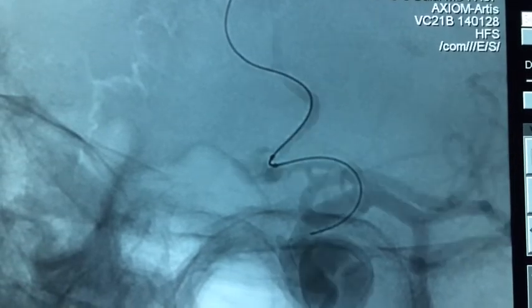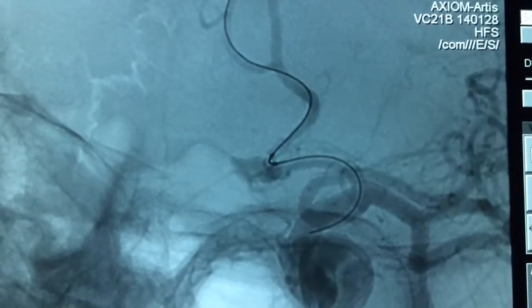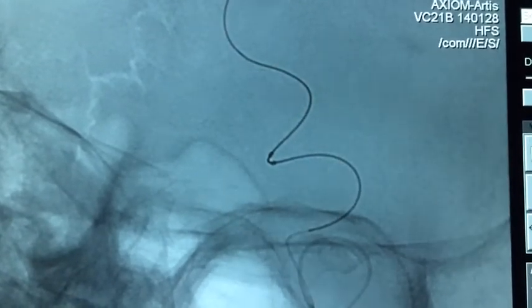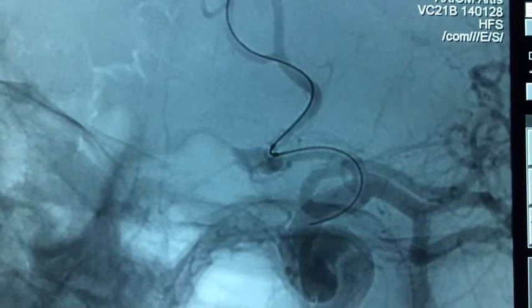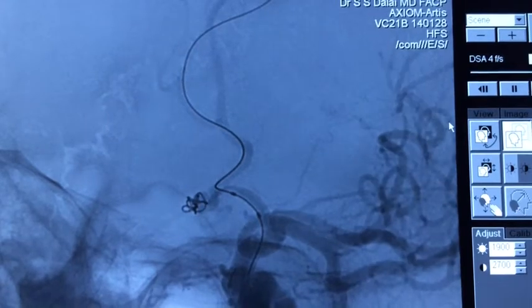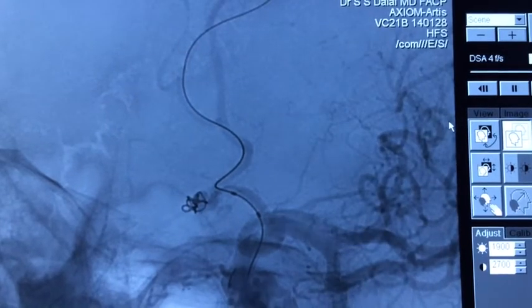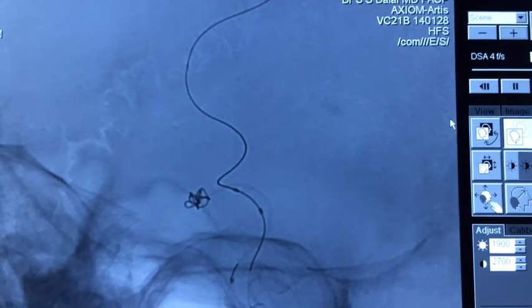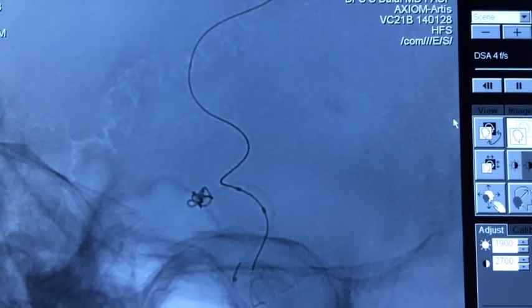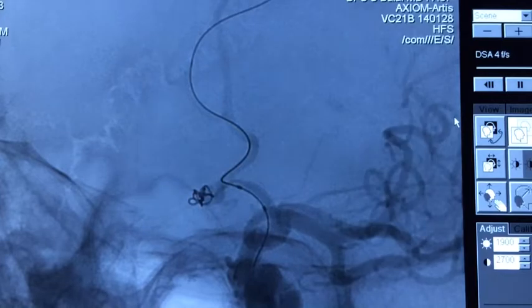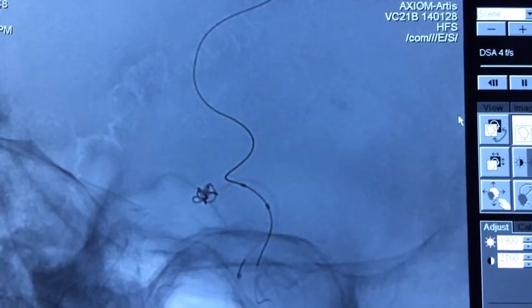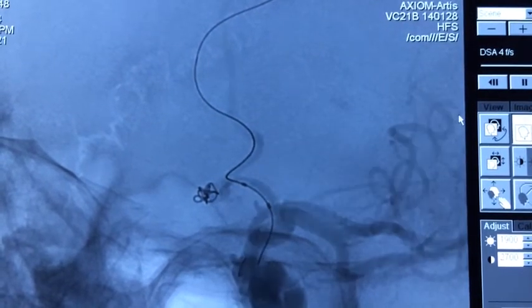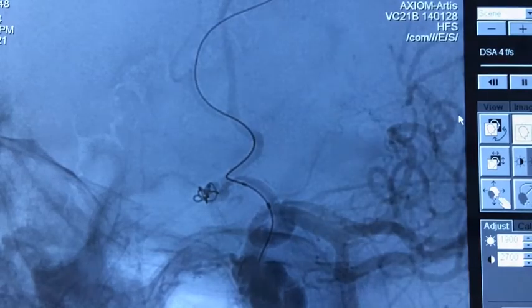We navigate the coiling catheter — the Echelon — and advance it into the dome of the aneurysm. This is the first coil going across nicely. We pulled the balloon back slightly to allow the coil to seat properly. This is the image after detachment of the first coil.